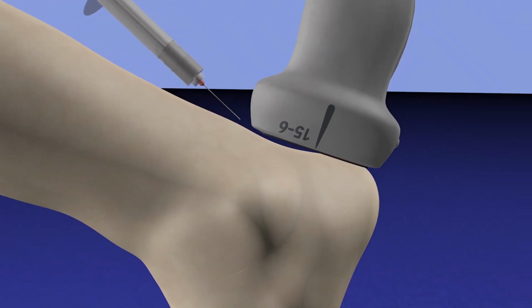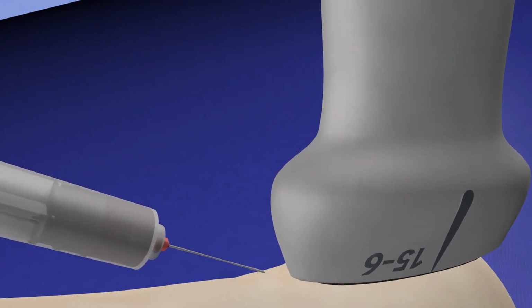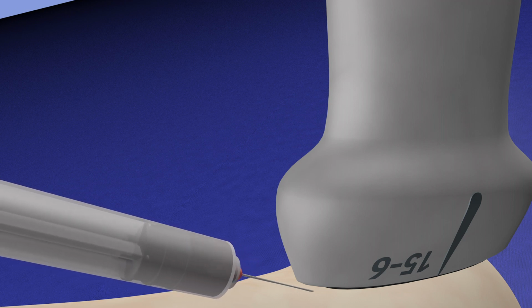So here's a gross depiction of the procedure that we're going to perform. The needle is going from a proximal to distal direction in line with the Achilles tendon fibers. And here we are starting our needle fenestration or needle tenotomy of the distal Achilles tendon as a way to try to elicit healing mechanically. And also this needle fenestration can elicit bleeding, which can help healing as well.